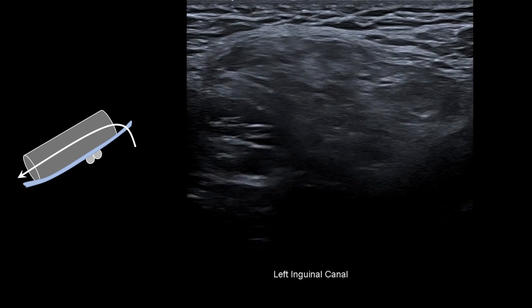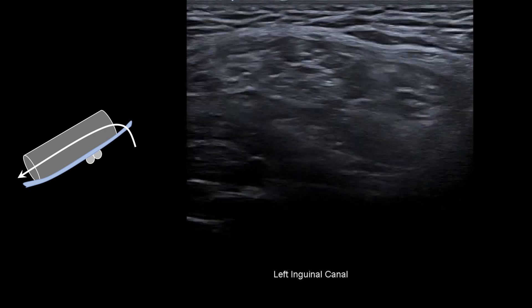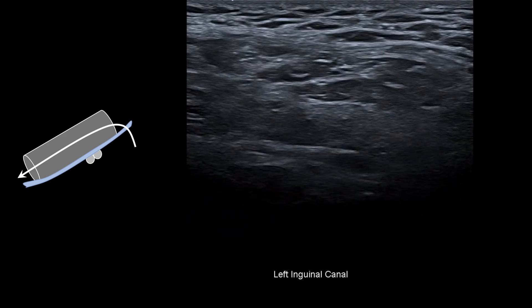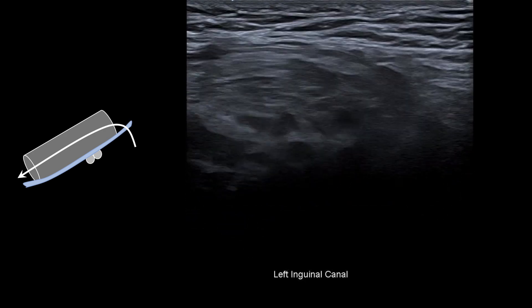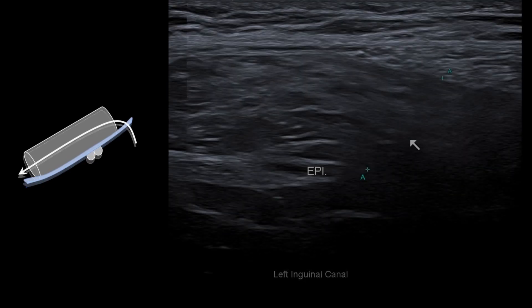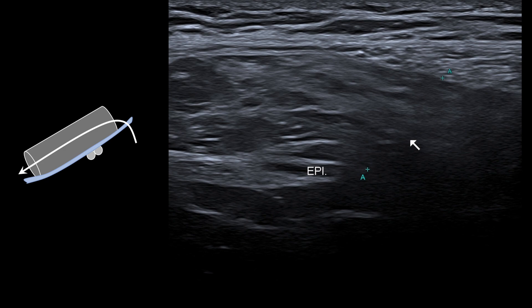Here we can see fat moving through and distending the canal. The defect is lateral to the epigastric, and as such, we have an indirect inguinal hernia.